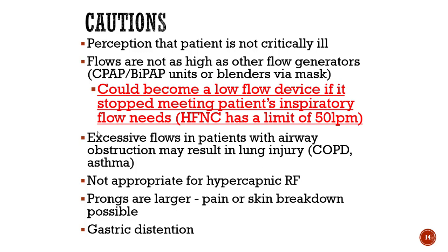Not appropriate for hypercapnic respiratory failure. That again goes back to: you would never ever use this as a way to treat somebody with a high CO2. The prongs are larger, so you do have to be aware of skin breakdown.